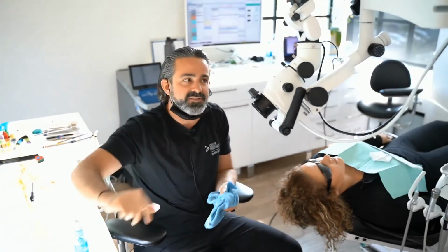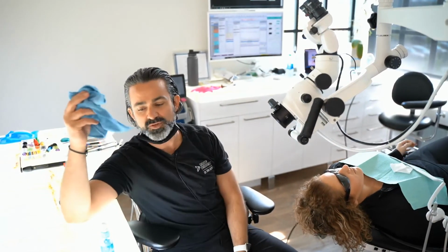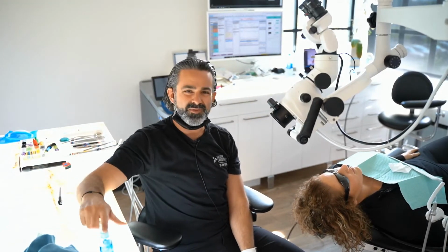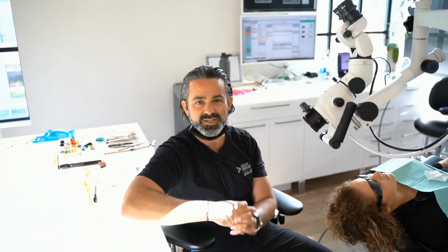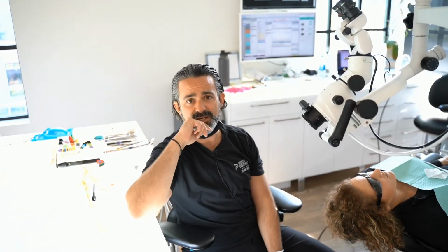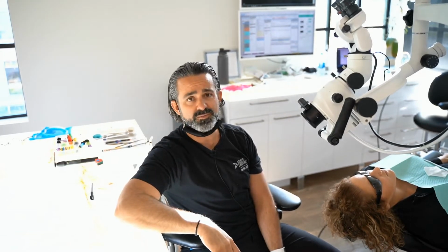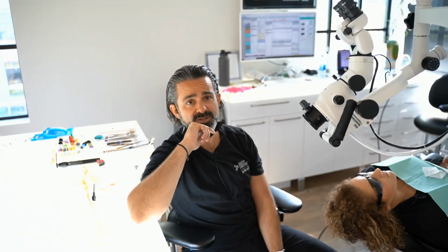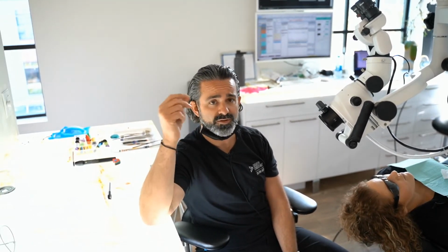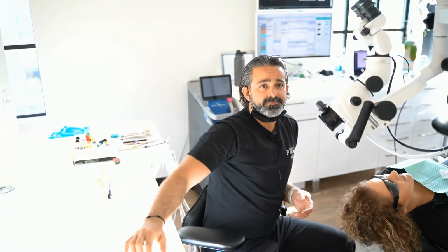So you do have to clean the lenses. Like I said, you can use the disposable caps the company sends you, or wash microfiber towels. But to get in and out, especially in a general dental practice where you see a lot more patients a day than I do, in that kind of high-volume turnover I would use the Kimtech cleaners. You clean test tubes and everything else with them, and they work fantastic. Kimtech also makes a lens cleaner with their cloth. So, great question. Good questions.